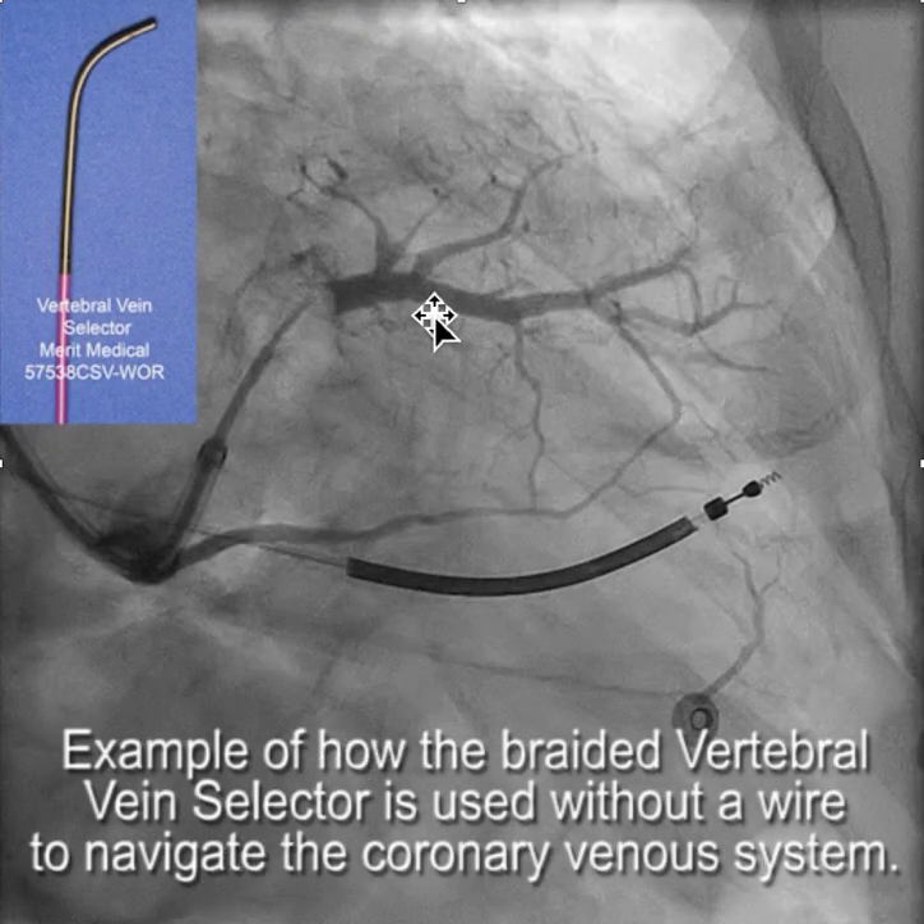We had this anatomy and decided we would like to put the LV lead into this side branch. We thought this might be a little too far apical, and that it would be more stable if we could get the lead nice and deep into that branch.